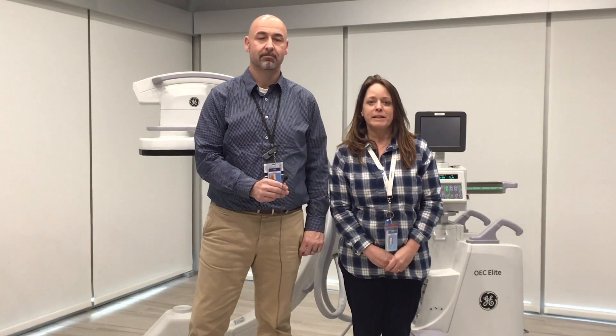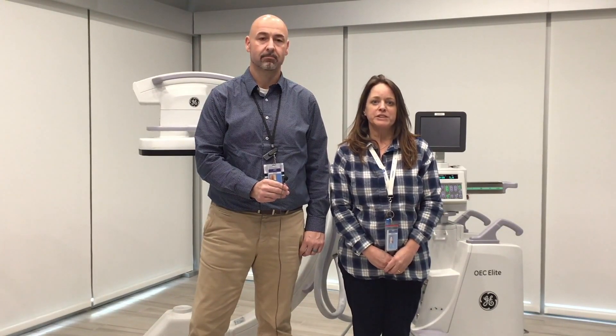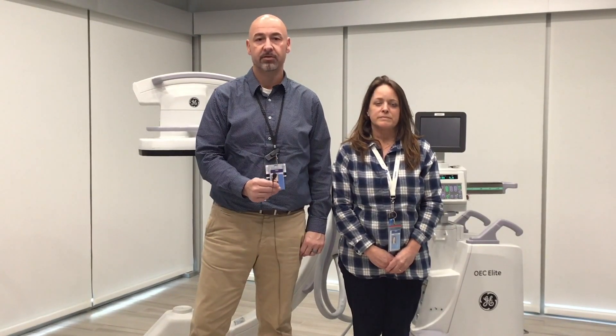Hello, my name is Rebecca Hammond. I'm a Clinical Imaging Specialist with GE OEC. And I'm Sean McClemon, I'm the same title — Clinical Imaging Specialist for GE Healthcare Surgery. We're going to show you some of the breaks and locks on the CLM to help you with positioning for your surgery cases.